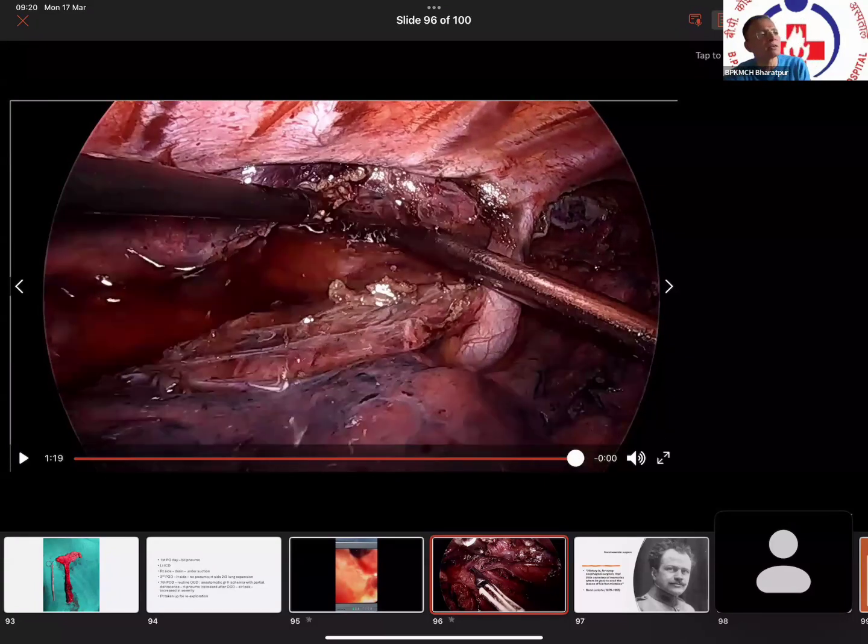The thing was that this patient also had an opening of the contralateral pleura. I thought that because he has blebs on the right side, maybe he has blebs on the left side also. I didn't pay much attention. I thought this is just the CO2 which had entered the contralateral chest cavity. So, realizing there is no leakage from the major tracheobronchial tree, as per the description in this picture, we closed.